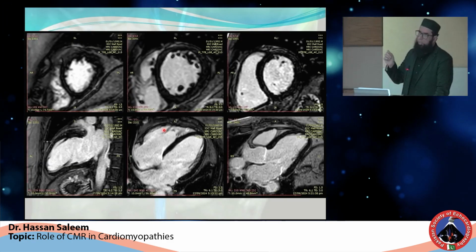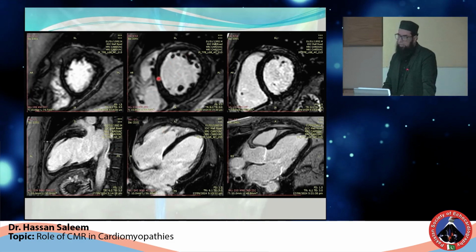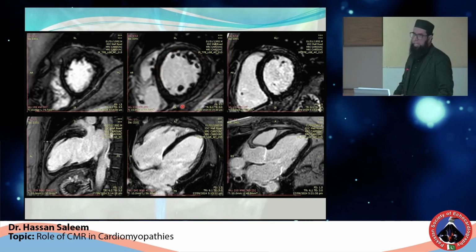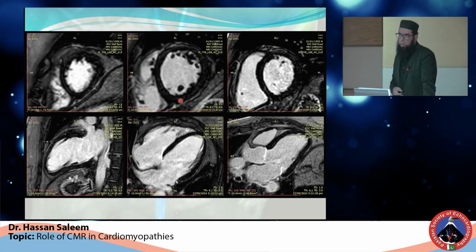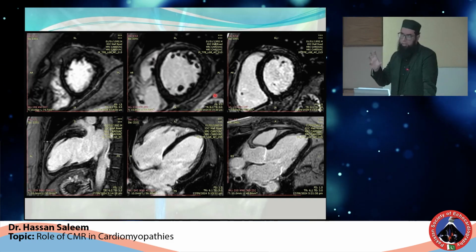Then we do nulling of the myocardium. Again, it's physics, but the normal LGE for you is a black one. So it should not be enhancing anywhere. Sometimes the contrast is retained within the fibrotic or the infarcted tissue. So that is very much clear in the background when the normal myocardium is all jet black.